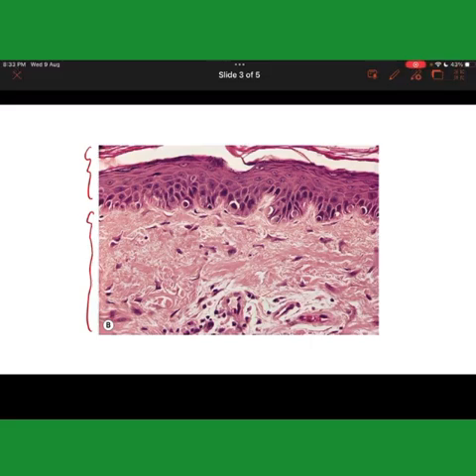So in the epidermis, what do you tend to see? There are some pycnotic cells with dark blue nuclei, and there are even cells which have abundant pink cytoplasm with a pycnotic nucleus. We call these cells apoptotic keratinocytes. As you know about apoptosis, the cells will be shrunken, the nucleus will be pycnotic, and if cytoplasm is there, it tends to turn into a brightly eosinophilic cytoplasm. So that is apoptosis.